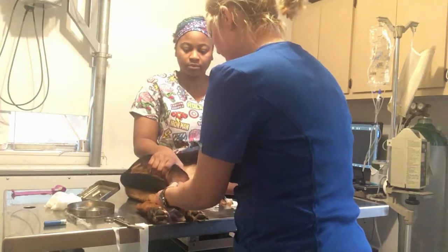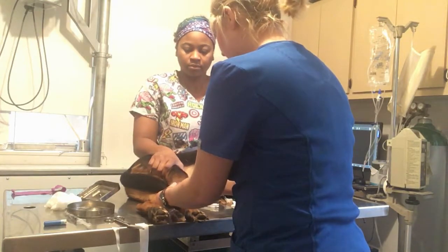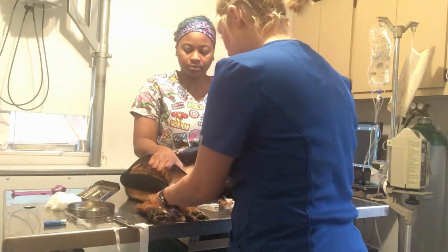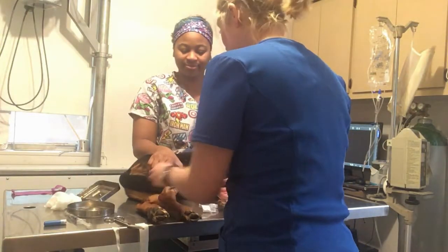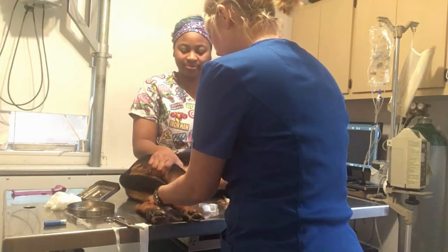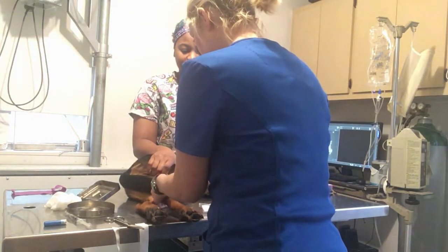So once you have the catheter successfully threaded and you are getting blood, you're going to hold it off, and then you're going to insert the plug into the catheter.